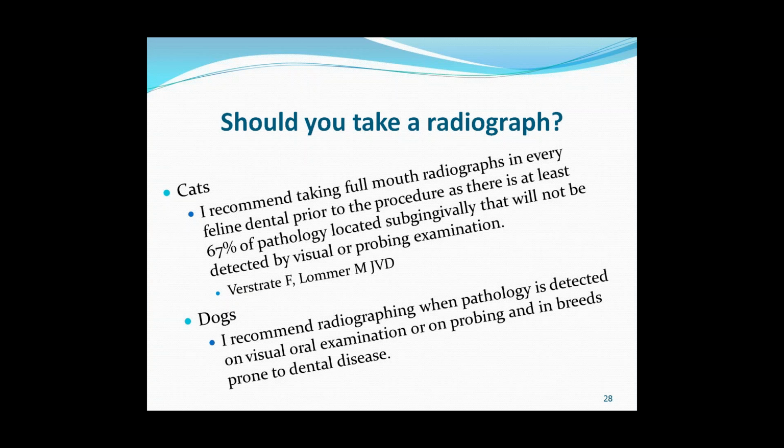Whenever you see pathology, either on an oral exam or on probing, you would also be able to justify taking radiographs.